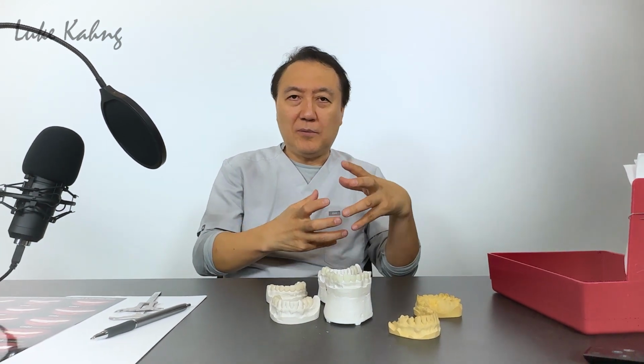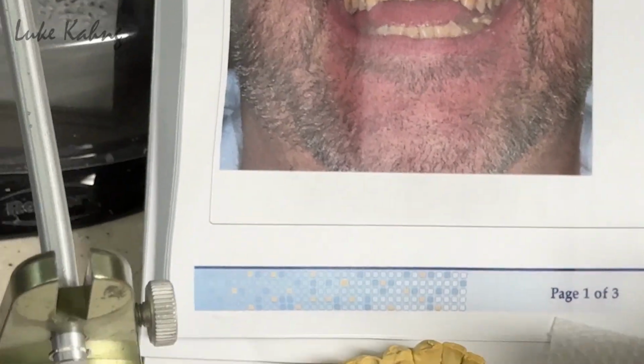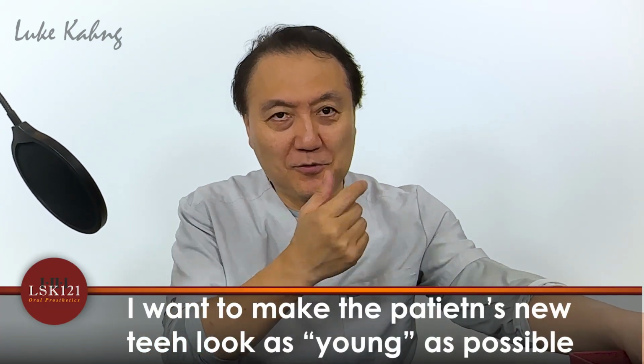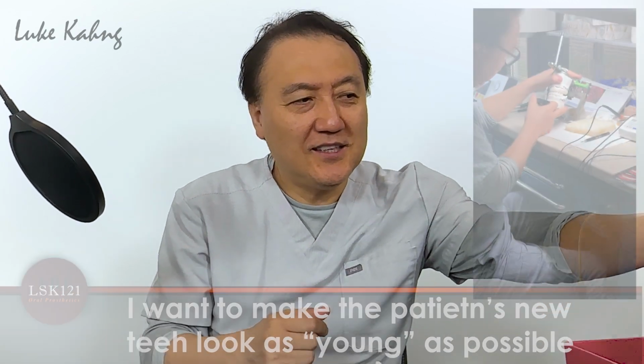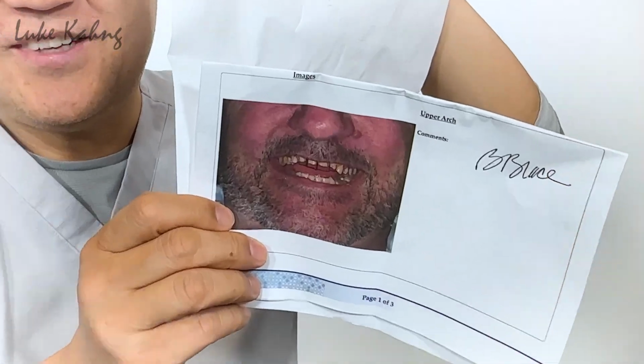He sent me great pictures from when the patient was young. It's nice with a spouse. It's great, lovely. And now he's getting mature, so he needs some changes compared to this. So my build, my initiative, my studying, I'm trying to make him look as young as possible, as when he was young. So that's my key. So from this here, right?